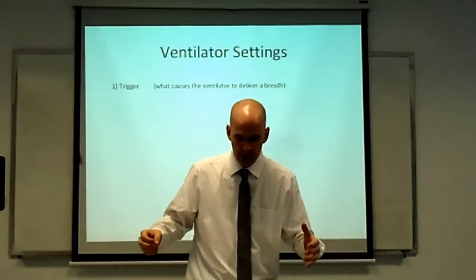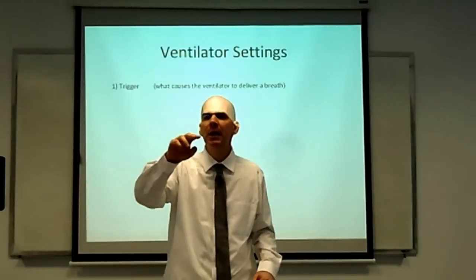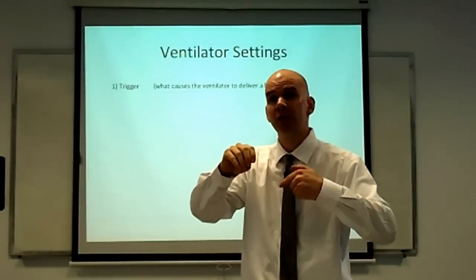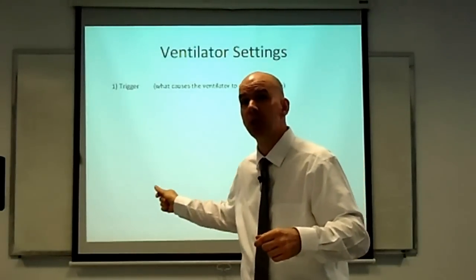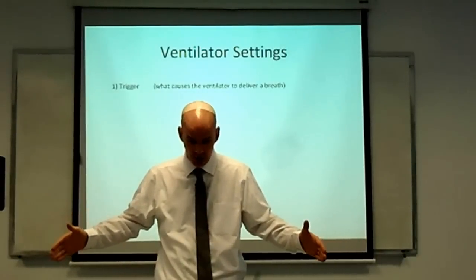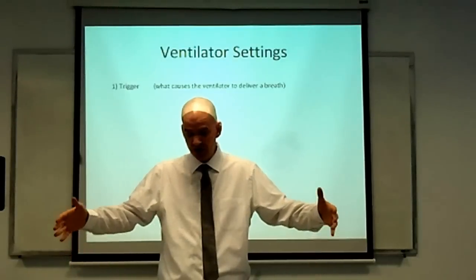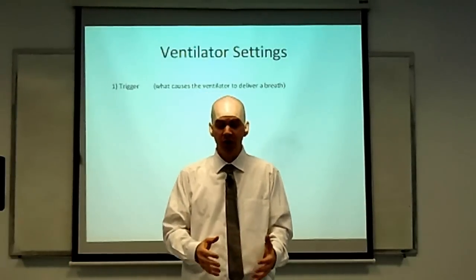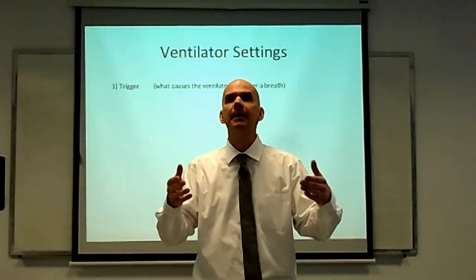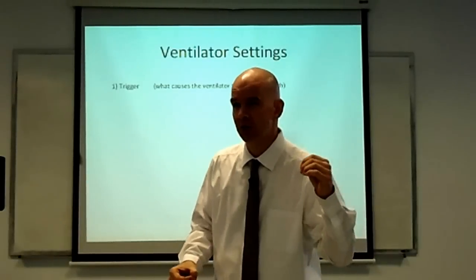A patient, for instance, might be mid-exhalation, and the machine might pick up a little oscillation in the pressure, misinterpret it as an effort to take another breath, and fire a breath inappropriately. Remember, I said the patient hadn't finished exhaling yet, so this new breath comes in before he finished exhaling. This new breath stacks on top of the old breath, and the patient's lungs get blown open further and further, and he can get excessive stretch and a complication called barotrauma that we'll discuss more later.